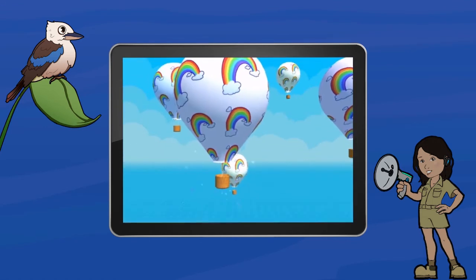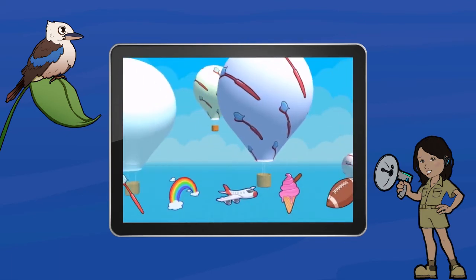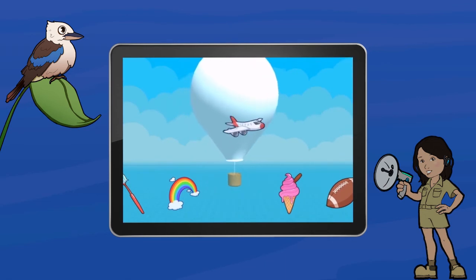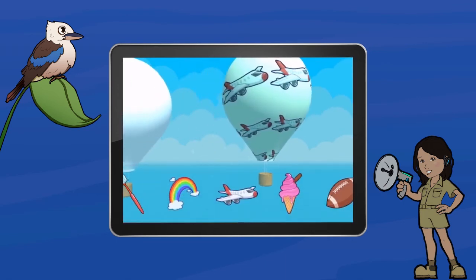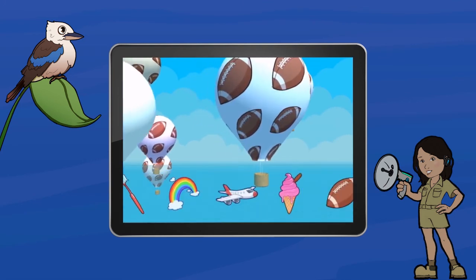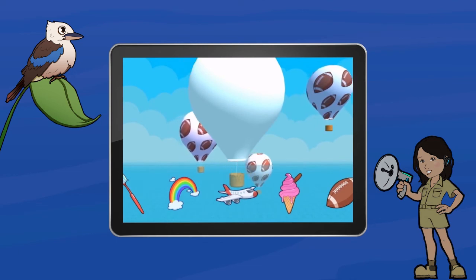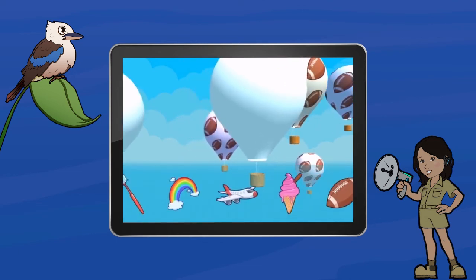Try not to interfere with the testing process. If your child seems confused, reassure them by giving them a gentle tap on the shoulder and point to your ears to encourage listening. If you need to, remind your child that it's normal to not always hear something. You can't pause the test, but if something has gone wrong and you need to restart, you can quit the game by tapping 3 times on the top right-hand corner of the screen.